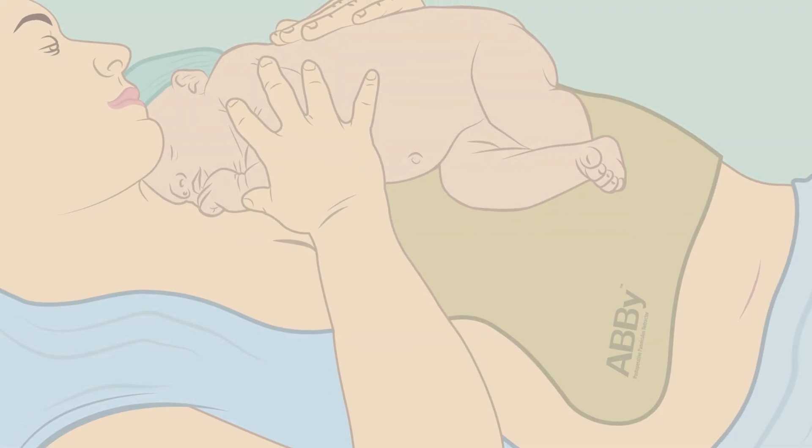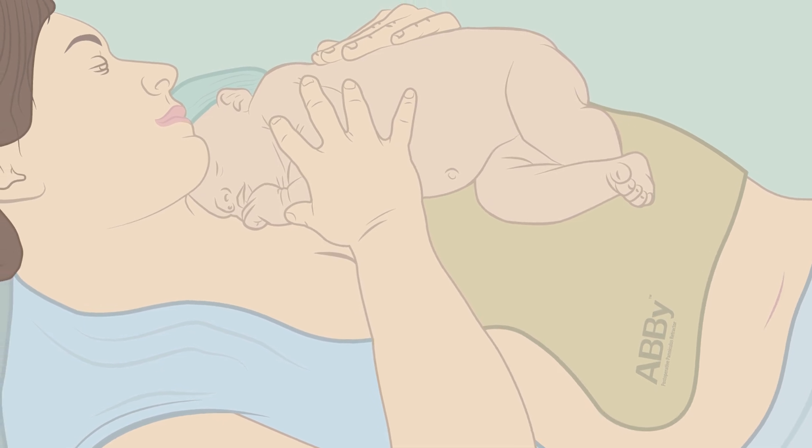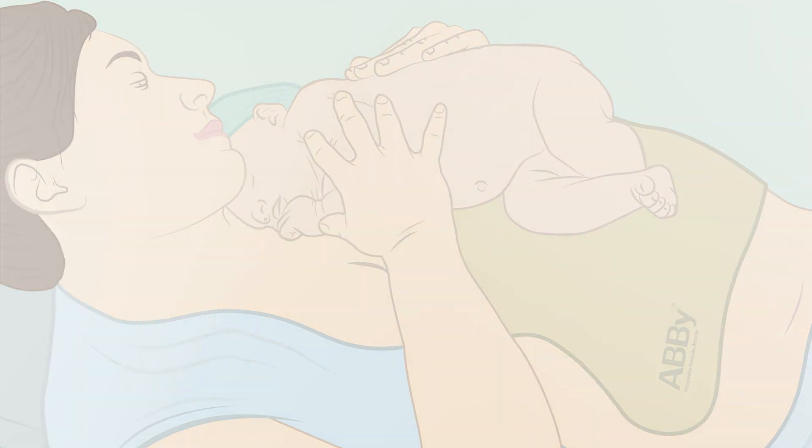Abbey is a medical device that we use post-operatively for patients after they have their c-sections. It attaches to the lower belly and it helps to retract the pannus. This can help keep it dry post-operatively, help us assess the patient better during their post-operative visits, and potentially even decrease the risk of infection.